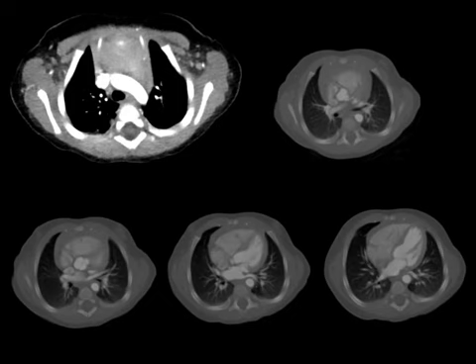And here's this actual study, and there wasn't a sequestration, so this is normal. Don't deal with whether there's an abnormality or not. But what I want to point out is, again, this is a non-gated study. That is the aorta. Look, you can see the cusps of the aortic valve. You can see where the pulmonary veins come in. Origin of the coronary arteries here. Here, see that? Really nicely depicted. Very low dose exam. We don't need a low pitch because it's not a gated cardiac study.